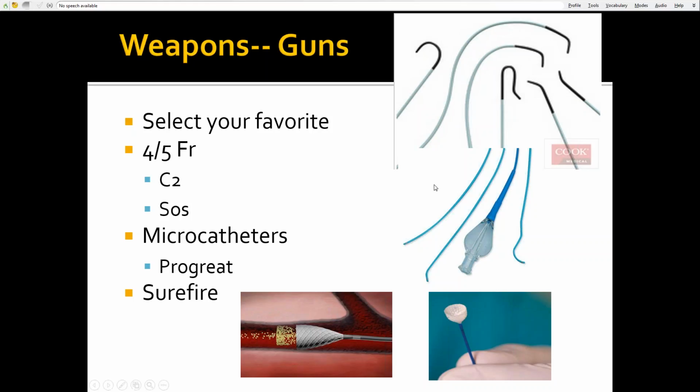And then you move into the world of microcatheters. Some of them have just a tapered edge or a straight edge, or sometimes a funky hooked edge. So whatever it is that you need in order to get into a vessel, they have many micro wires that you can shape to help you navigate into the vessel that you want to get into.